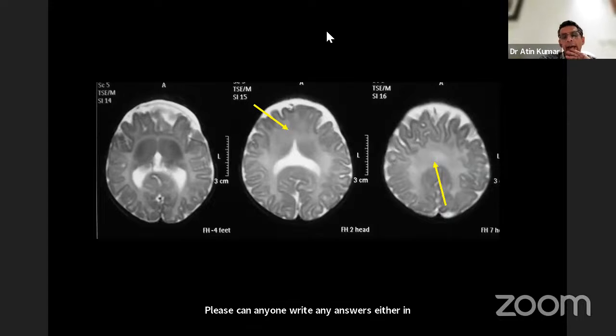Okay, great. Absent corpus callosum, excellent. I do not see a corpus callosum here. Brilliant pickup. What else do you see? Besides corpus callosum, what is this? And what is happening here? Great. The answer given by Dr. Sanjay Wazir is absolutely fine.